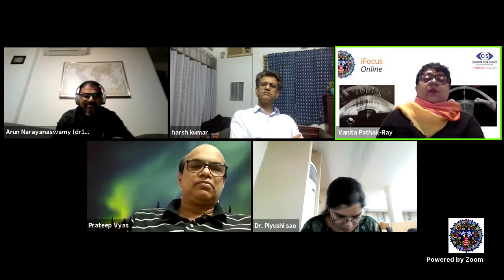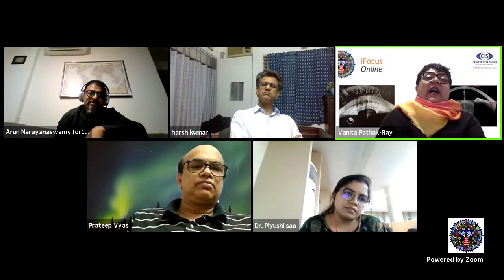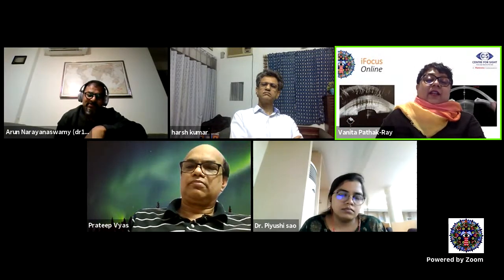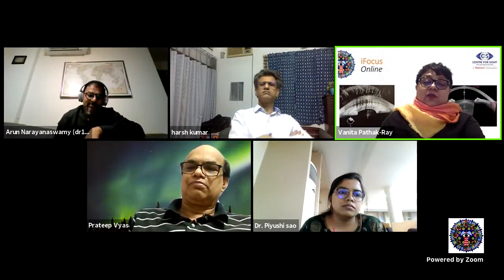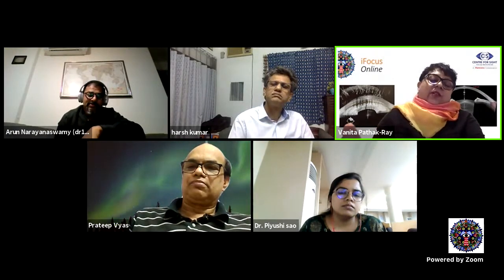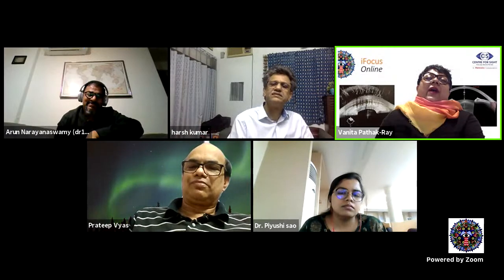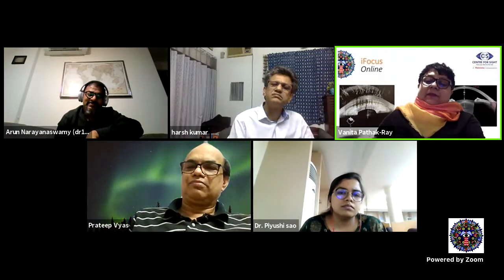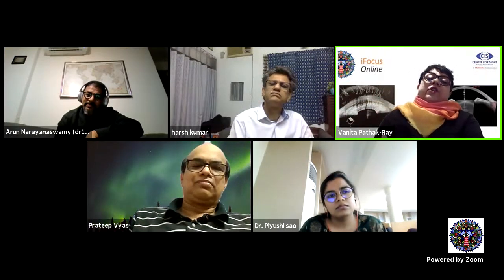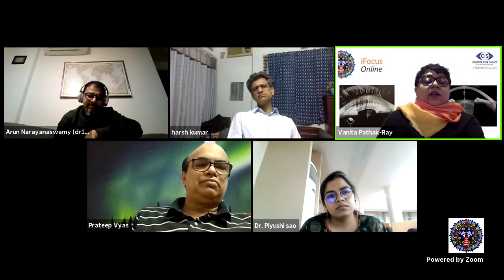I saw a beautifully formed posterior chamber, very, very rarely picked up. Post PI, of course, all that vanished. But he also had Plateau iris syndrome with a significant lens vault, so even that was contributing. One question I wanted to ask you before we say goodnight, and thank you for your time: would you not do a UBM post PI when the angles are still occludable? Because you're assuming that it's only Plateau iris syndrome which is contributing to it and not lens vault.